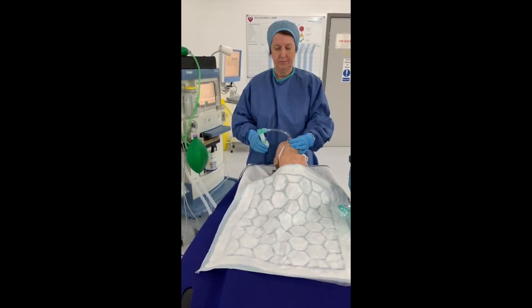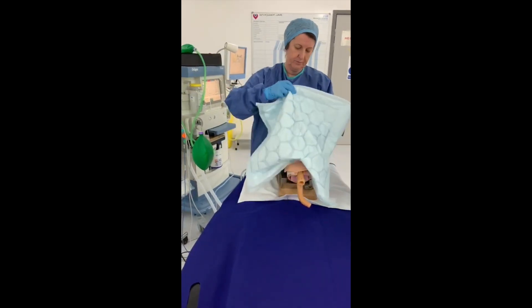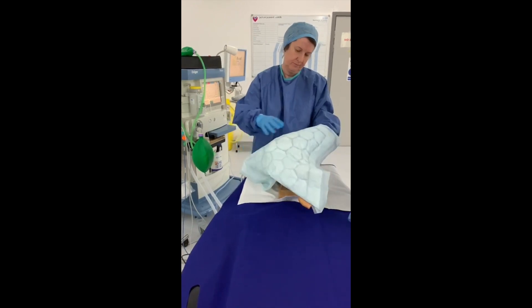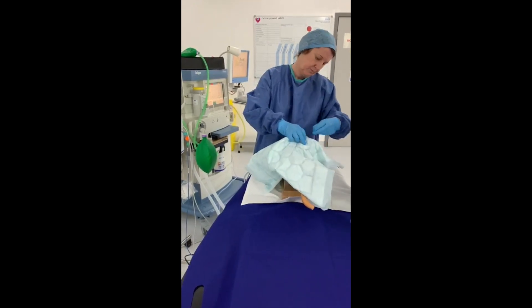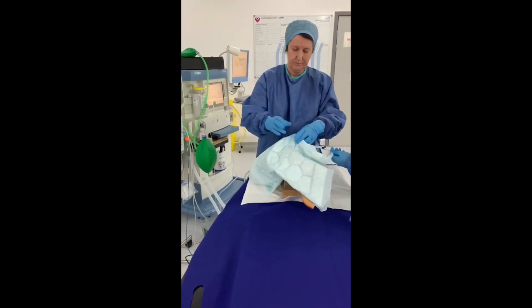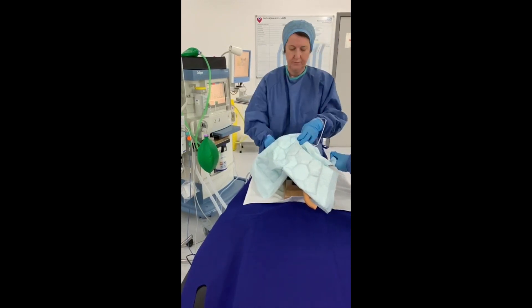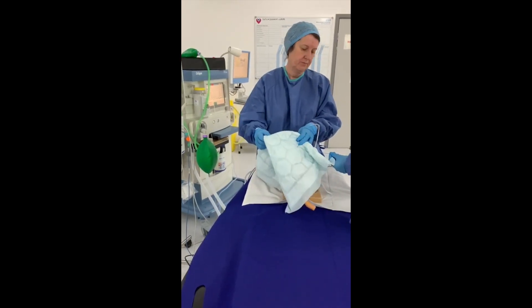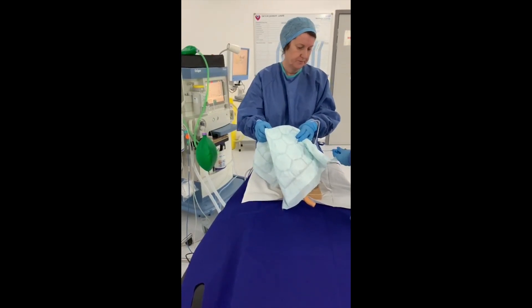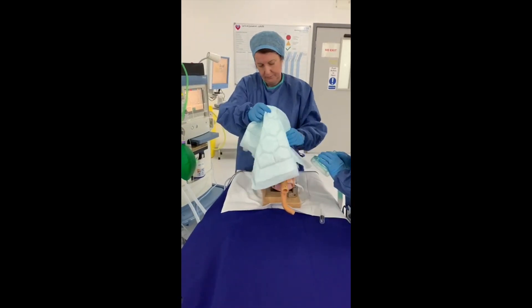The intubator covers the patient's face with an inco sheet, waterproof side up, encasing the ET tube, catheter mount, and HME entirely. Ensure the pilot balloon is accessible to assist one. On the intubator's command, assist one deflates the tube.